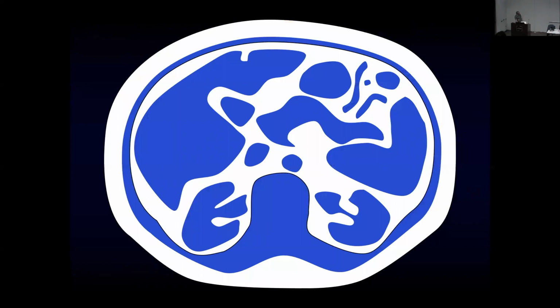Well, let's go back now to our image where we have water-based tissues such as liver and fat-based tissues such as adipose tissue. And remember that our MR images do not have infinitesimally small pixels.